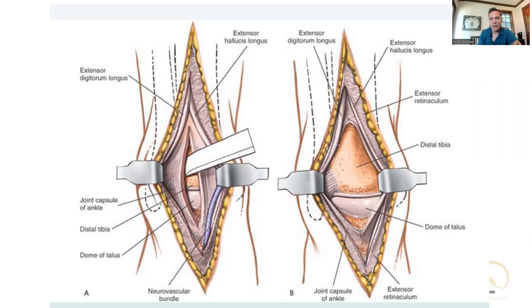I'll use Army-Navy retractors, one medially and one laterally, which gives me pretty good exposure, particularly for an anterior approach for ankle arthroplasty. My neurovascular bundle goes laterally with this approach. In the Hoppenfield image they show it coming medially, but that's if you're between EDL and EHL. I go between anterior tib and EHL because I find it protects the superficial nerve a little bit better. The neurovascular bundle tends to sit just under the EHL and is nicely retracted and protected with that approach.